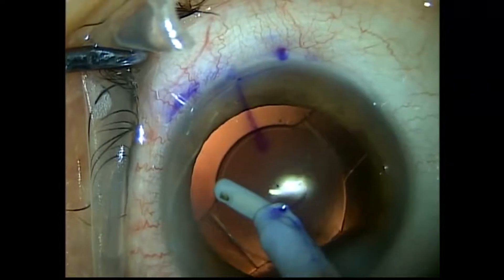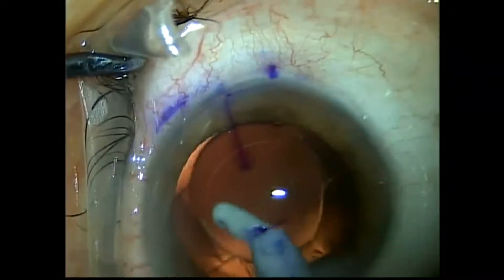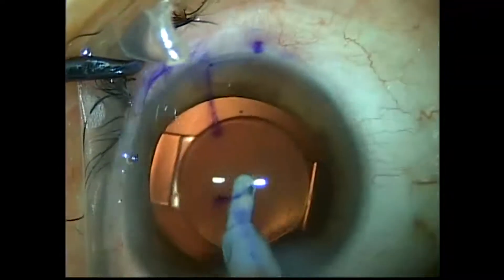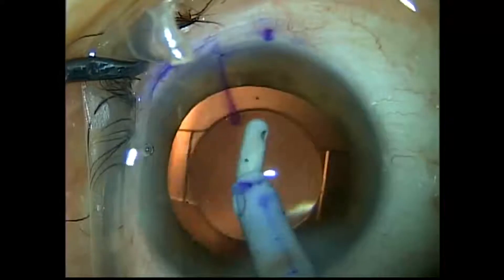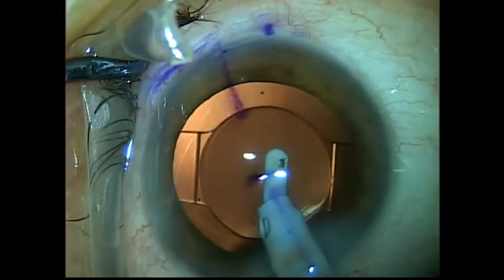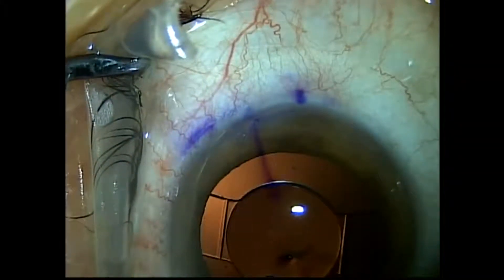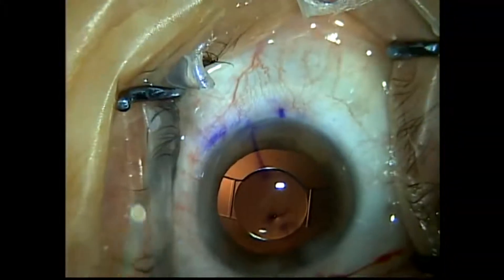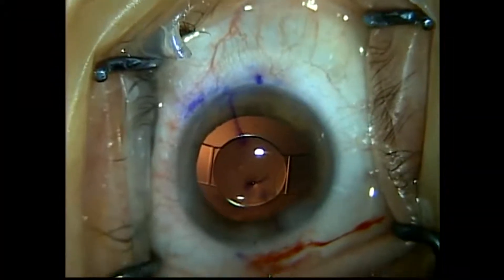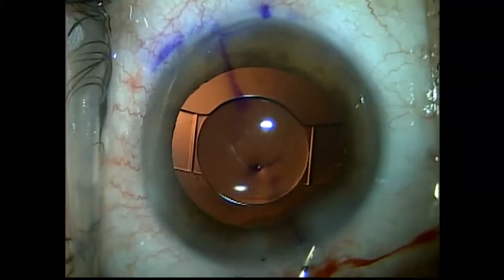I'll try to get rid of any tiny cortical fragments and place my IA tip behind the crystal lens optic to remove any residual cortex that may proliferate into posterior capsule opacification. I then stromal hydrate my incisions.